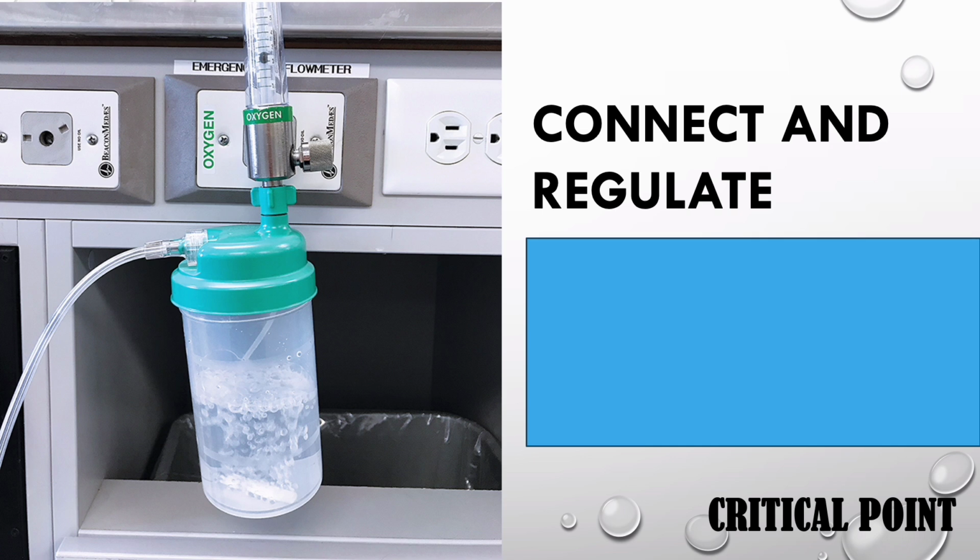Once you see everything is functional, regulate your oxygen to the prescribed volume as per the prescription in the patient's file.